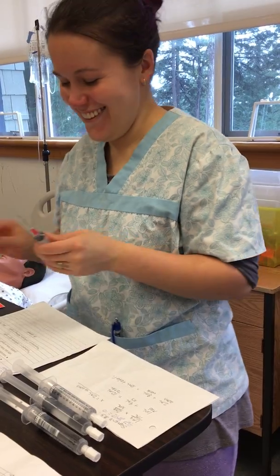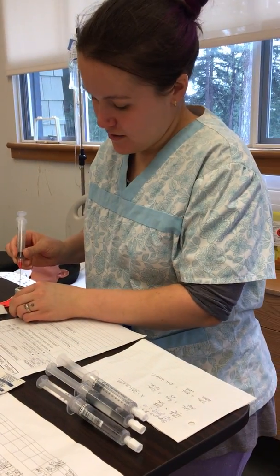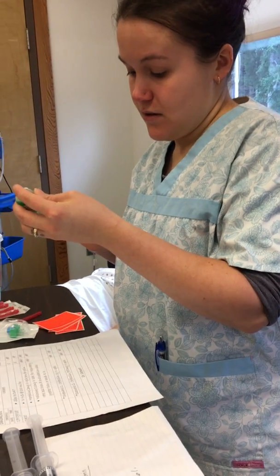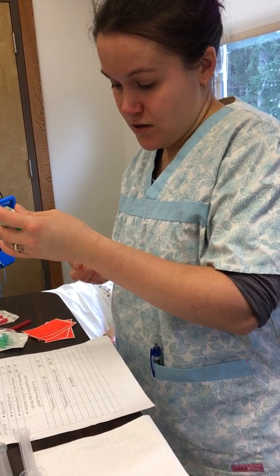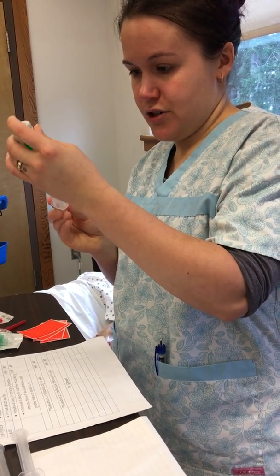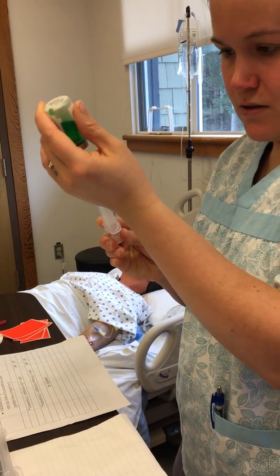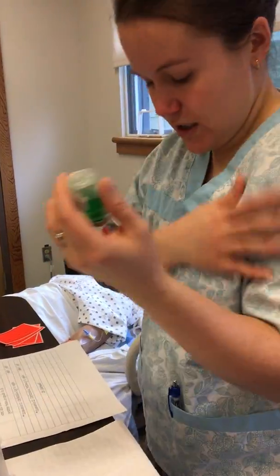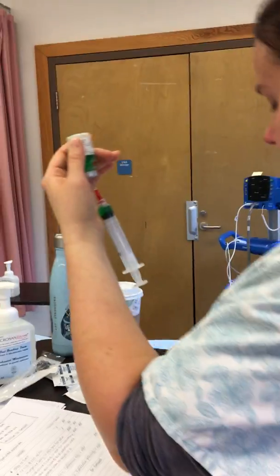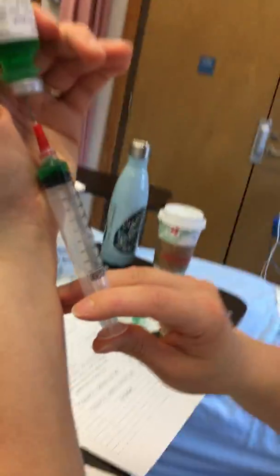Safe. And draw up 1 milliliter of air, which I wouldn't do if it was an ampule. You don't need to draw up the air. So take out 1 milliliter. I've struggled to get the pressure just right in this. It's not really just right at all. Okay, so I'm just going to draw up more than I need so that I can, oh, where's my pen? So that I can tap the air out. There, all the air's at the top. I can push. So now I have 1 milliliter, as you can see.